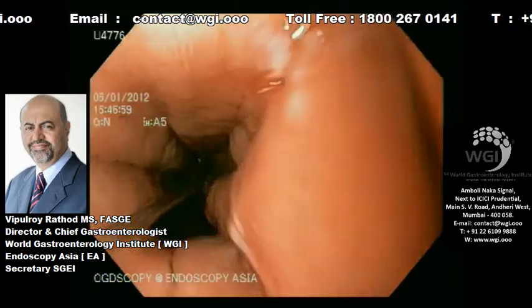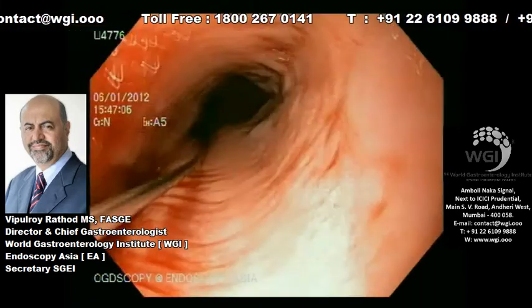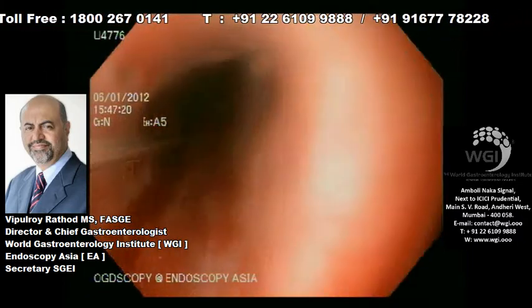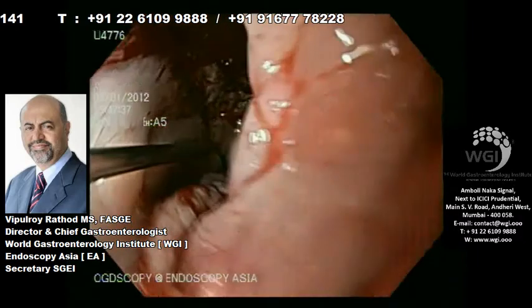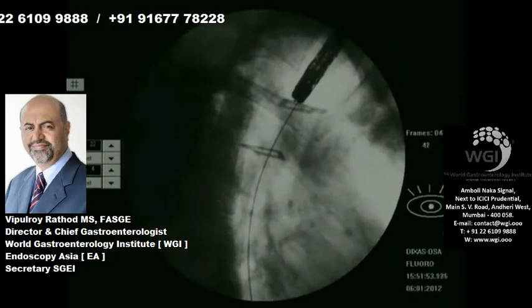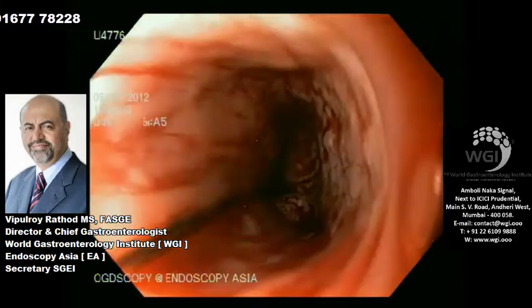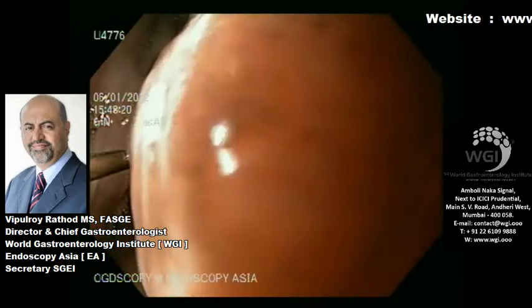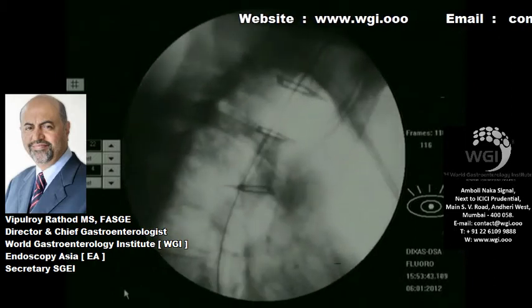Slowly I am withdrawing the scope and we decompress the stomach by sucking out the air. On fluoroscopy we will put a marker on the lowermost edge of the tumor. I can see some nodule there, so I know that we can put a stent below that — you can see the lower end of the tumor. We are putting a radiopaque marker in the form of a blade covered under 3M Micropore tape. Now we have marked the upper end, that is the upper esophageal sphincter area. We know that we can go up to this point to deploy a stent, because this is an upper third lesion.